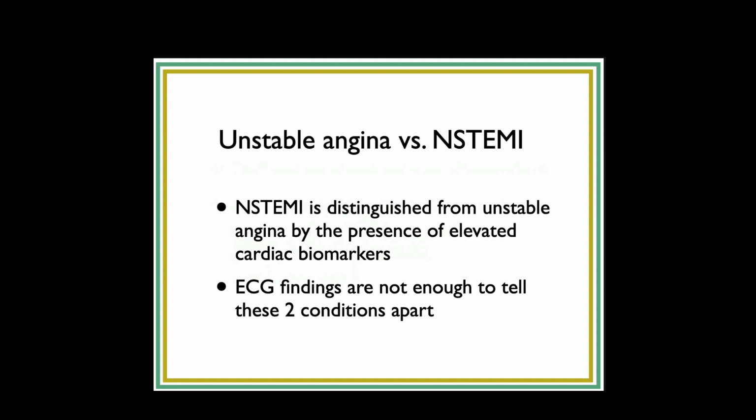So you don't issue a STEMI alert, obviously, because it's not a STEMI, but you're still going to a cath lab capable place, most likely. Let's go through the ECG findings. You're asking the most important question, well, what do we do? But let's go through the findings and we will definitely spend some time talking about that.